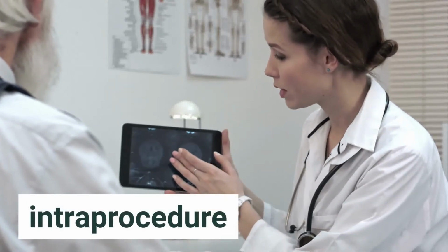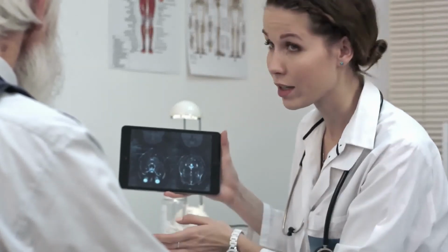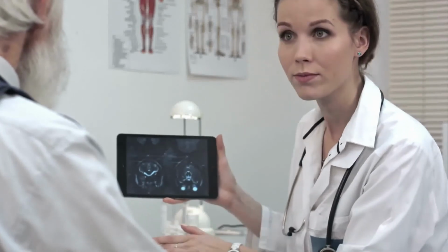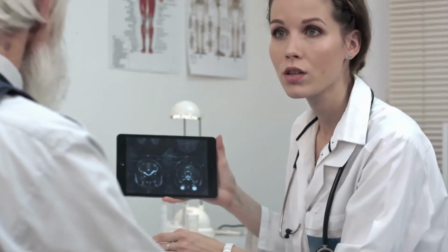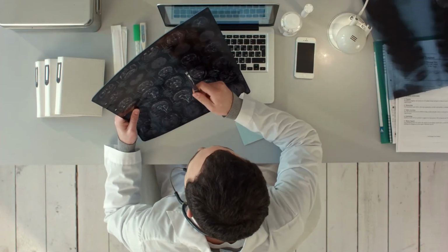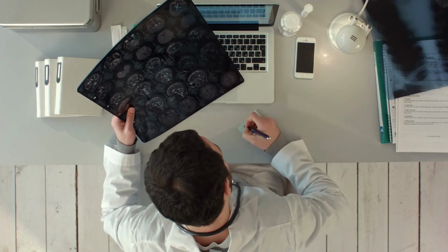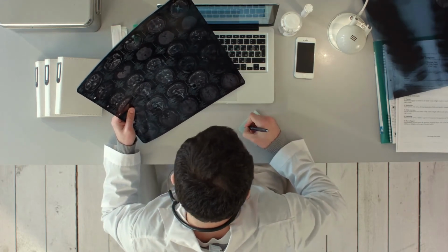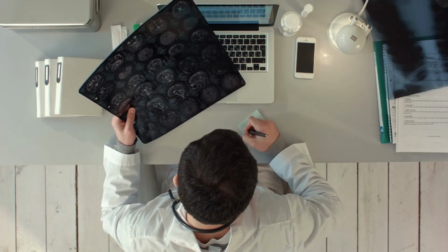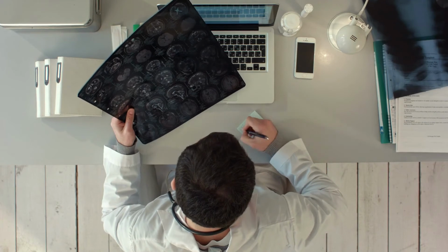Intra procedure. The client is placed on a radiography table where the client's head is secured. A catheter is placed into an artery, usually in the groin or the neck. Dye is injected and X-ray pictures are taken. Once all the pictures are taken, the catheter is removed and an arterial closure device is used, or pressure is held over the artery to control bleeding by thrombus formation sealing the artery.